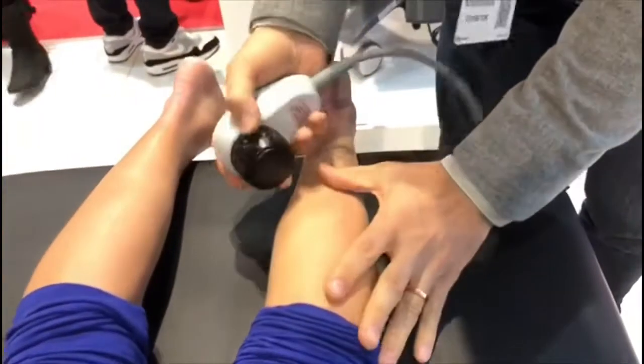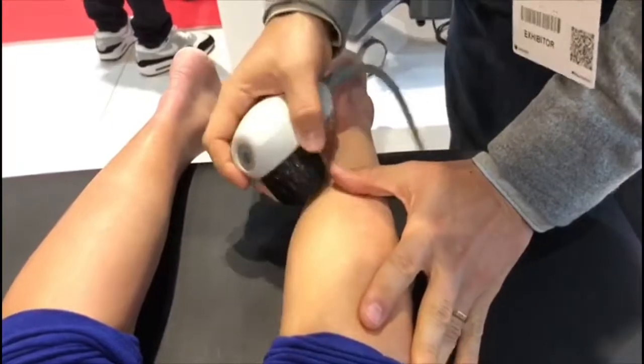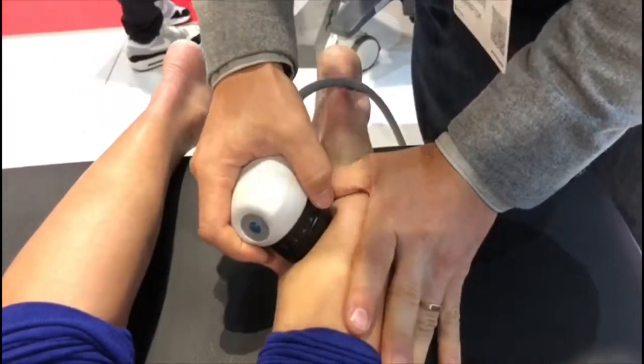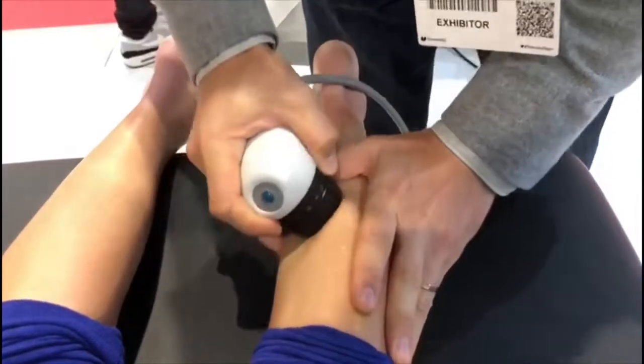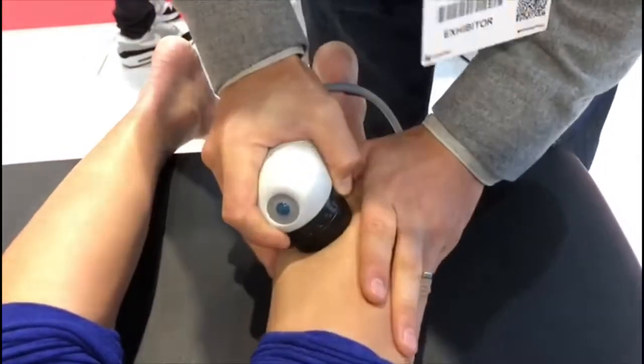And this is how it works. You can use it without gel, as I'm doing now, or you can use it also with gel if the skin is too sticky. This is simply massage, I would say.